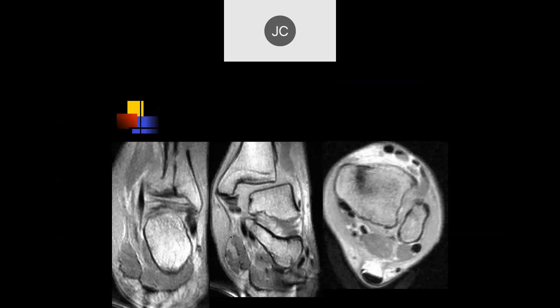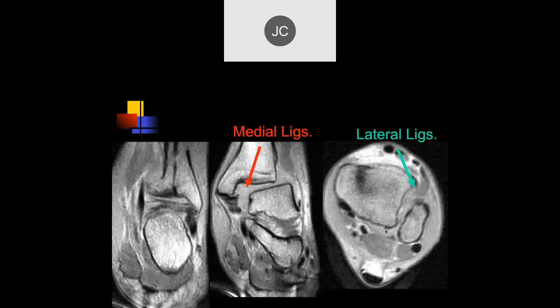It looks like we have a complete tear of the deep and superficial deltoid and dislocation. Certainly the deep deltoid is torn here, with marked instability and displacement. The anterior inferior tibiofibular ligament is torn as well. The posterior is probably torn. This is like a fracture-dislocation — and the lateral ligaments are torn too. There's a fracture of the fibula.